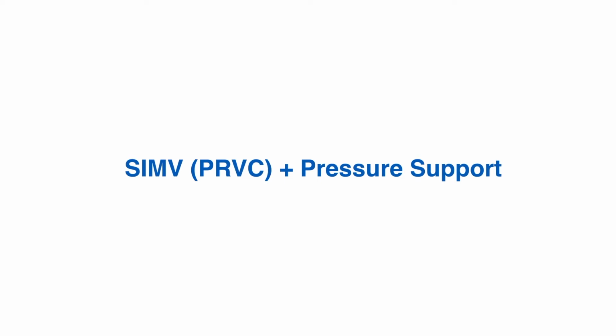So you're needing 17 to deliver the same tidal volume that was needing 25 a minute ago. And for me, that's one of the nice things about a volume mode of ventilation. You can see the compliance by keeping a trend on whatever peak pressures are needed, and it gives you an idea of what's going on in the lungs, whether they're getting better or worse.